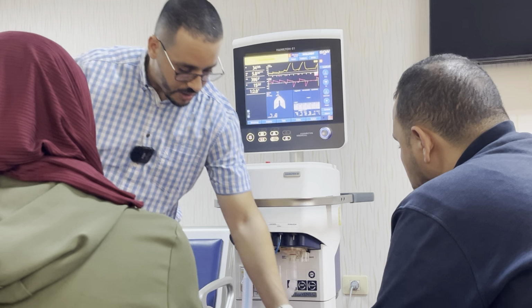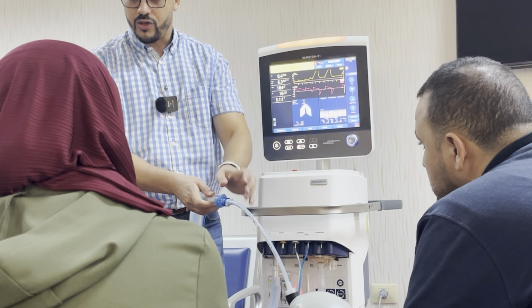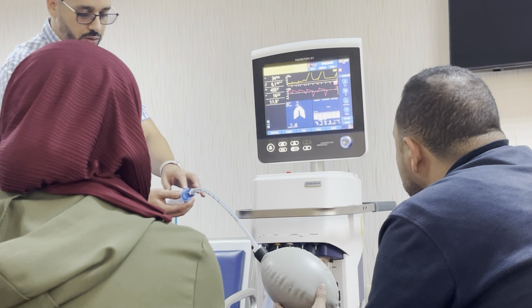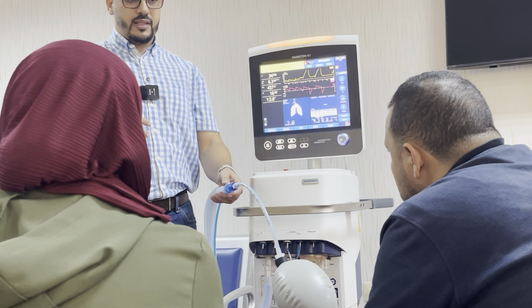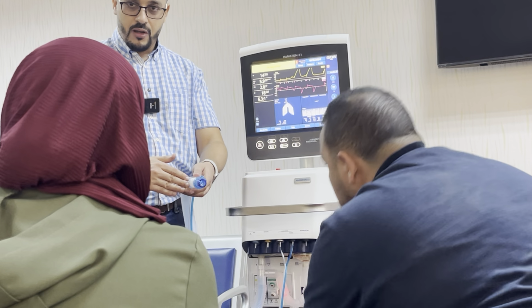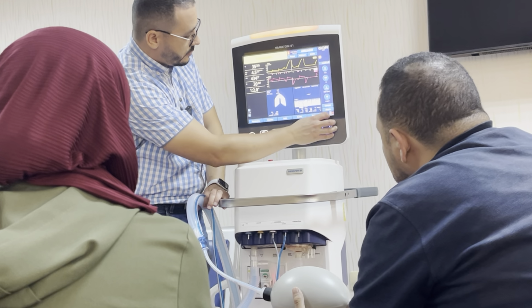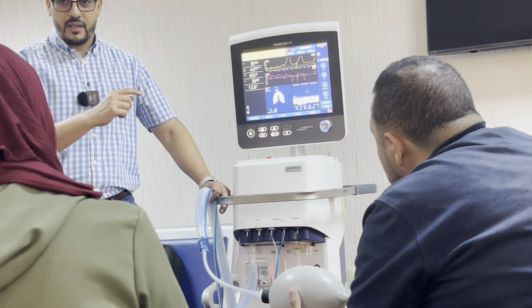So if the pressure here is measured at this, so this is the flow sensor, okay? The flow sensor is responsible for the measurement, which is displayed here. The flow sensor is detecting any airflow coming in or out from the patient because it's directly connected to the endotracheal tube, okay? So we have a PEEP of 5, and suddenly the patient will generate a negative pressure inside the lung in order to suck the air. So the pressure which was maintained at 5 will be reduced to maybe 2 or 3 centimeter water because the patient has taken out some of the airflow. So at that time exactly, you see the pressure was 5, 5, 5, 5, 5, and suddenly we have this peak down. This means the patient has initiated some breath.